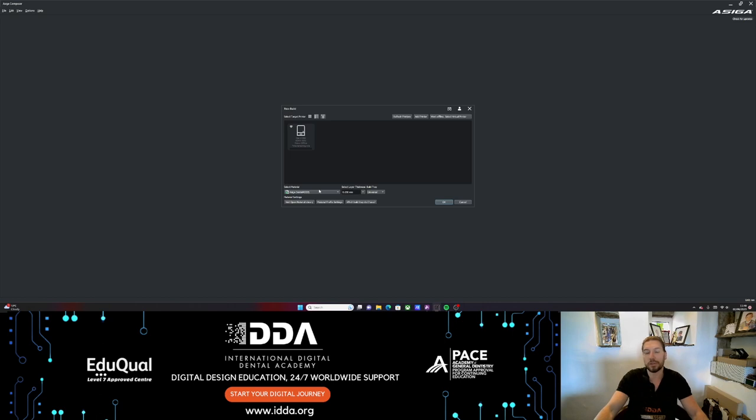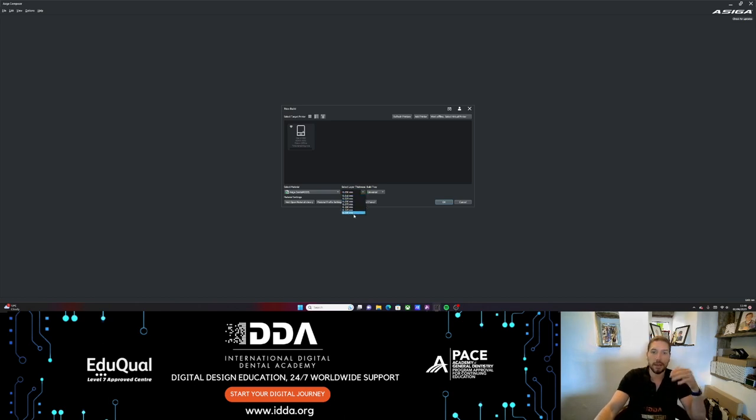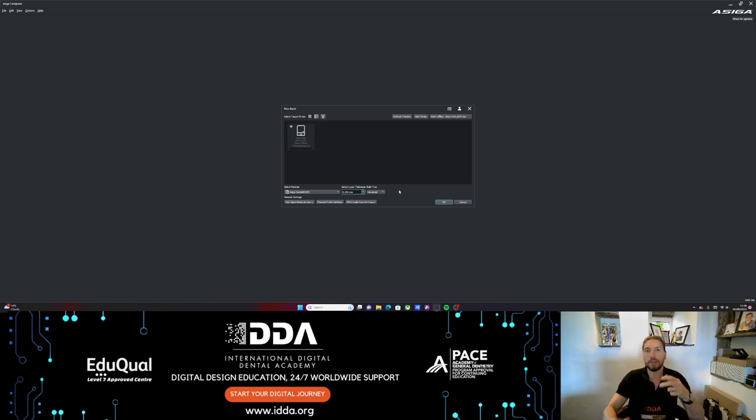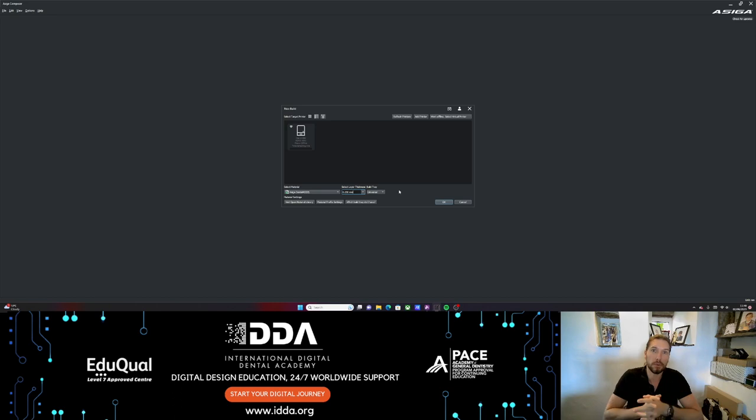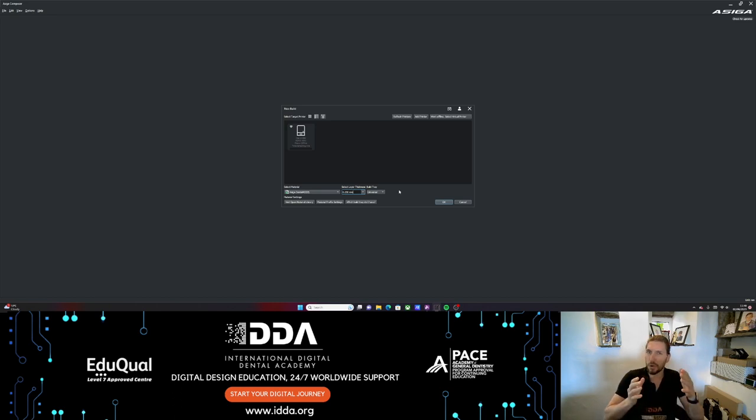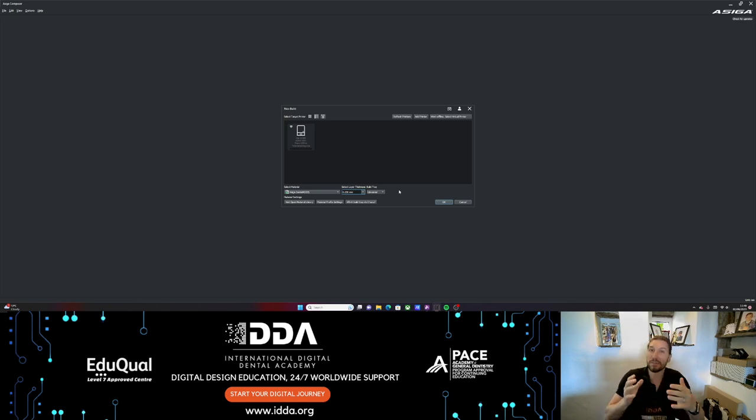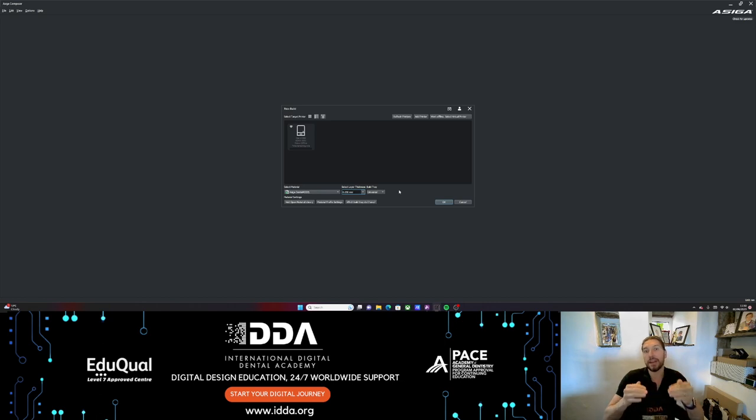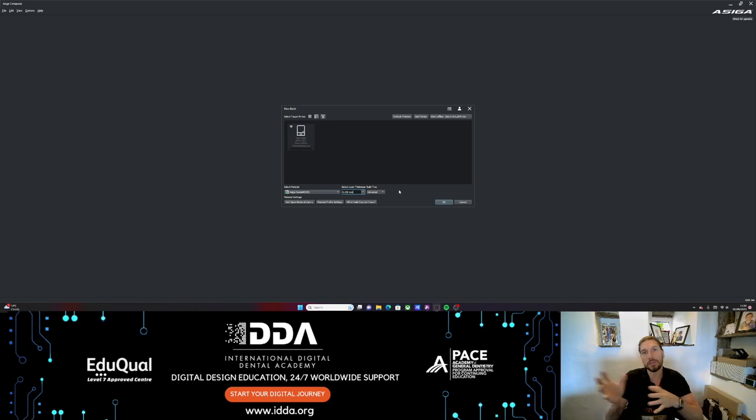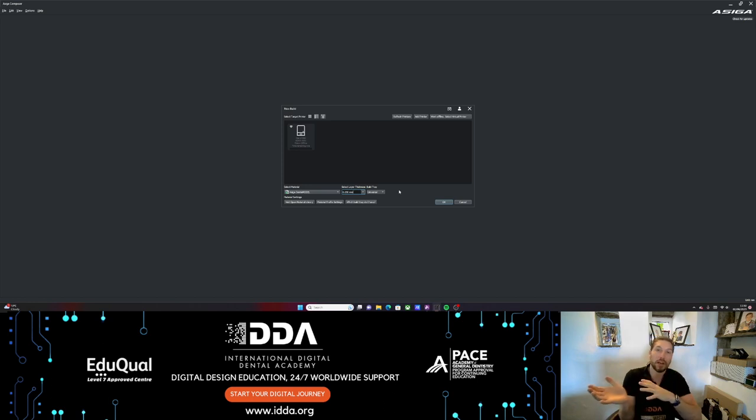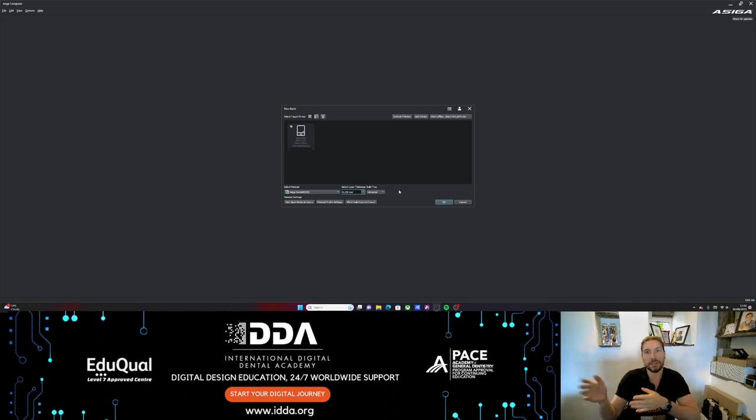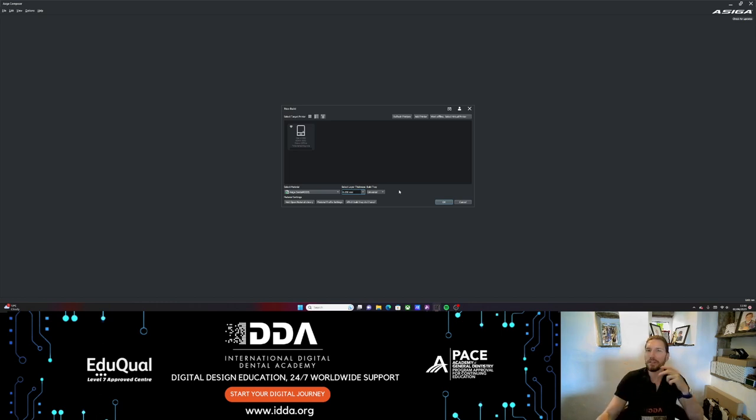Let's presume we're going to use the dental model resin which I've used last time. Same thing as usual, we have different layer thicknesses. For speed, if you want to increase that layer height, or for accuracy with less lines on the model we can reduce it. This is going to be a model for a DSD mock-up, a motivational mock-up for a patient, so I really want that to be quite a low layer thickness, around the 50 mark, at least 75 or less. When you print and make sure you have less lines, when we transfer that to the patient's mouth, you're not going to be passing on those details of steps in those layers. If you really want to go to town, maybe 25 microns.